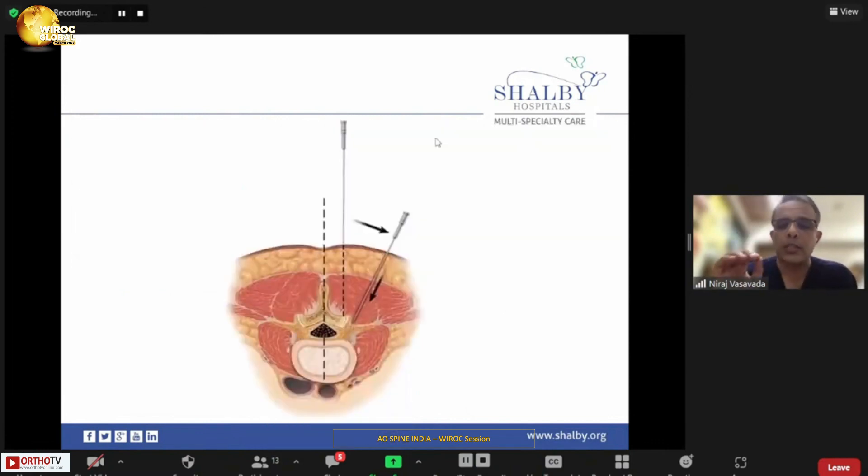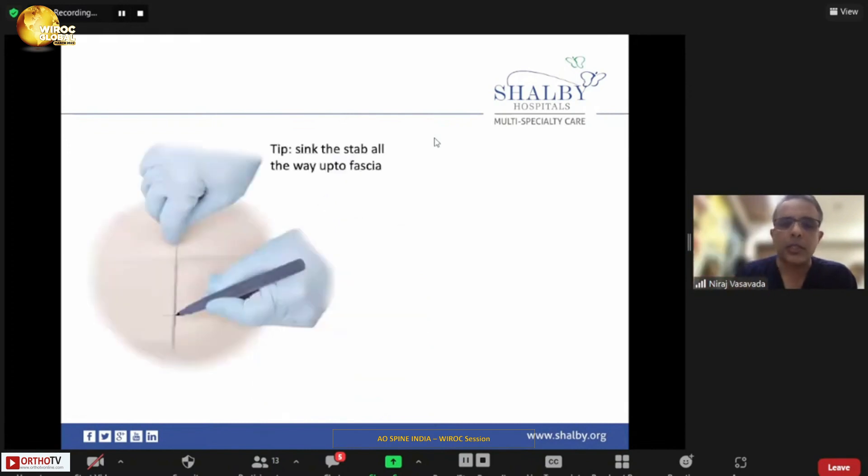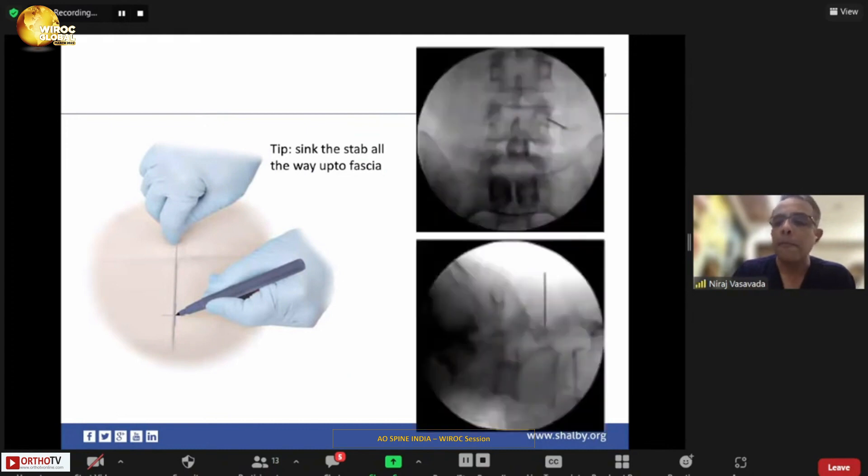Once you have studied the anatomy, the basic steps remain the same. Target your Jamshidi needle at the entry point under fluoroscopic guidance and plan your skin incision accordingly. Once you put the skin incision, jab your needle inside to do a liberal fascial release. Otherwise, the fascia would push your needle away from the ideal trajectory. A liberal fascial release is mandatory to place a properly angulated screw.